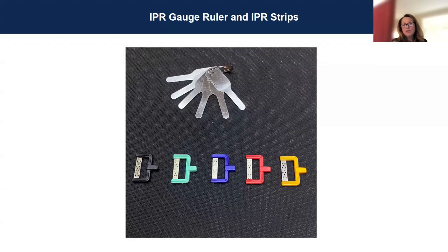And if you do any type of IPR, a lot of times for patient comfort, because some patients are more sensitive, you can barely do a little bit of enamelplasty and they say, I can't even breathe, my tooth is so sensitive. So after we get done doing the attachments and performing the IPR, then I will do fluoride, and that way it calms that tooth down.